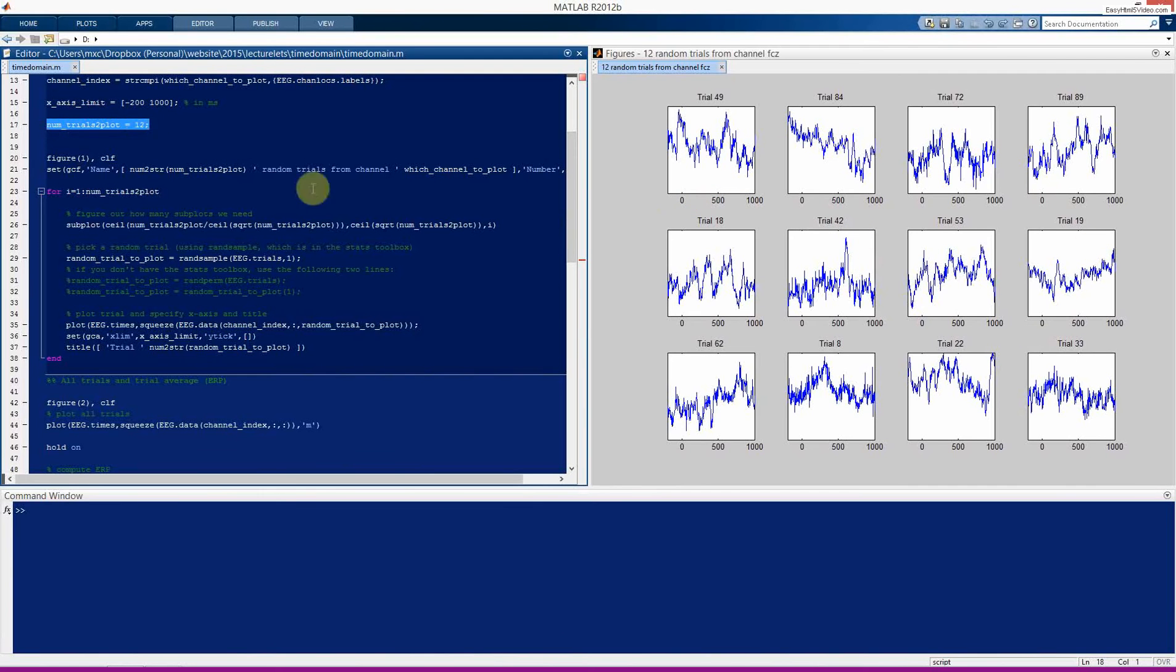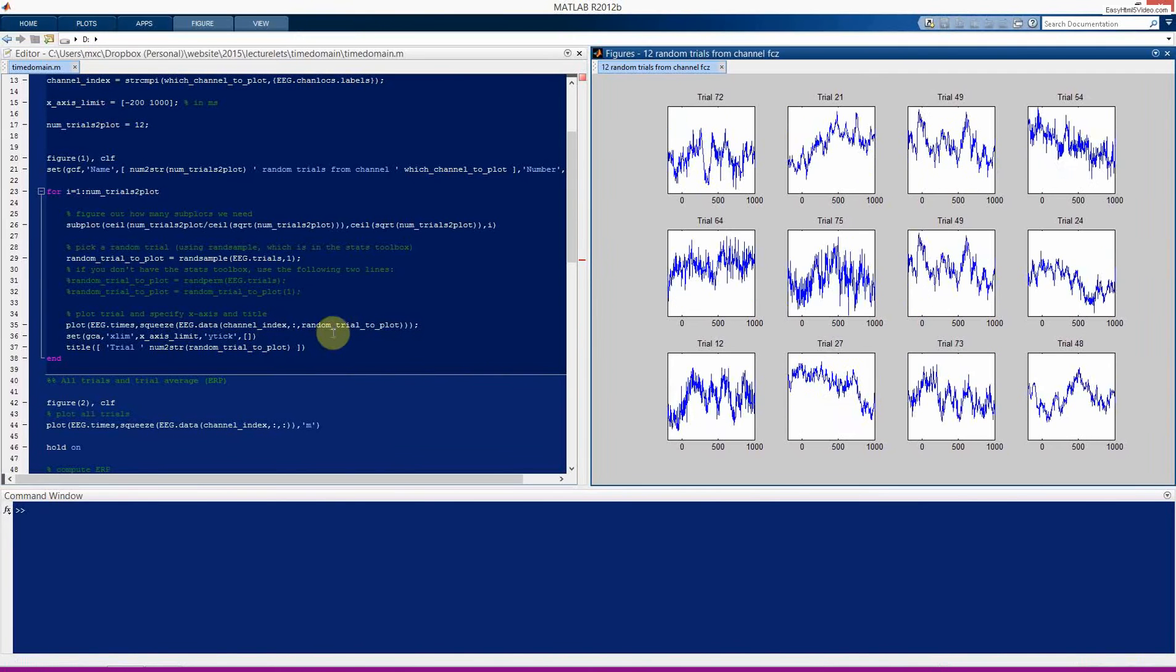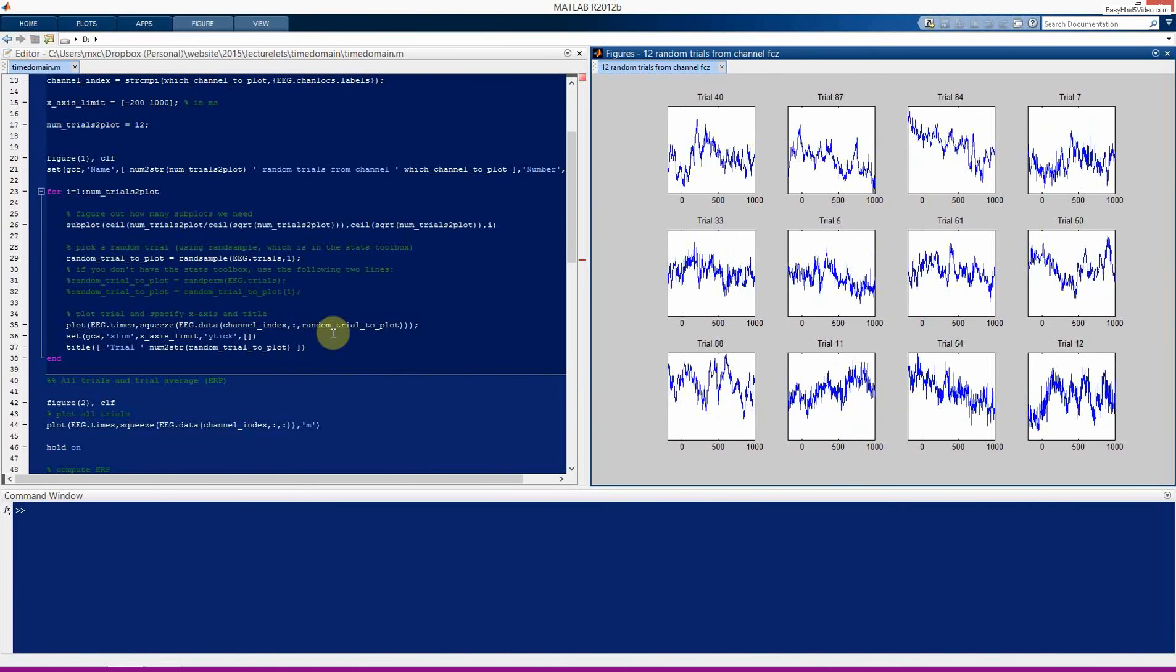Here we define a number of trials to plot. I just arbitrarily pick 12, you can also try changing this to some other number. Then this loop, you can run through it line by line and try and understand every piece of the code if you like. But it essentially just defines the layout of these multiple subplots, picks a random trial to plot, and then plots the data. So this is perhaps the most important line here. We are plotting the EEG.times, it's the vector of time points in milliseconds. And here we are plotting the EEG.data from this channel, all time points, and this random trial to plot. And it really is random. So you can try running this code over and over again, and you'll get different trials coming up each time.